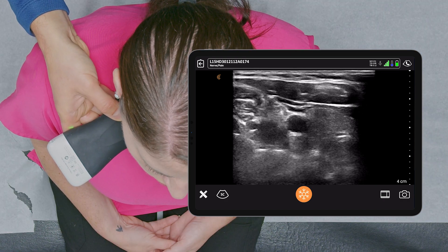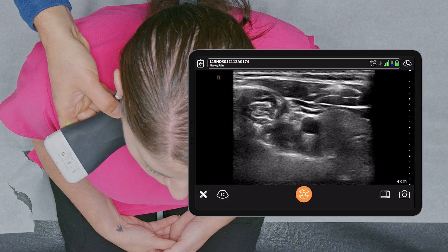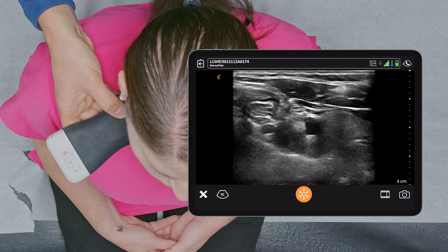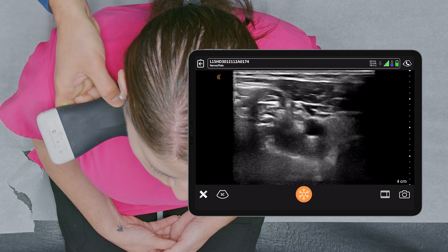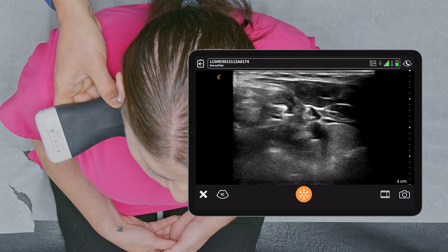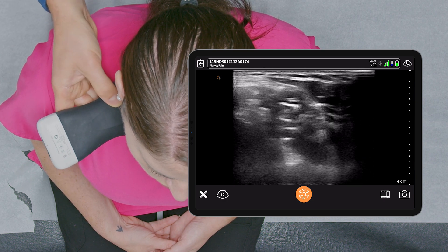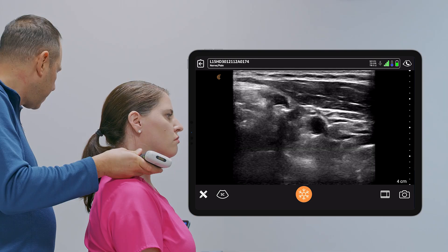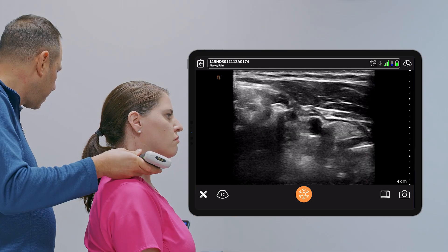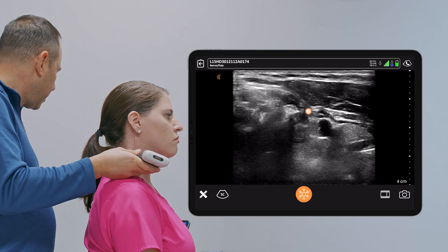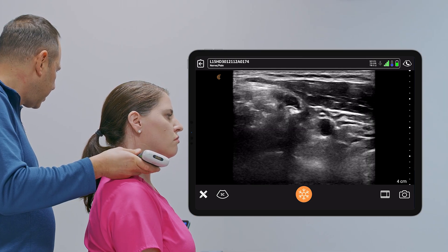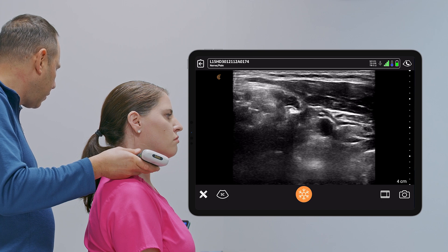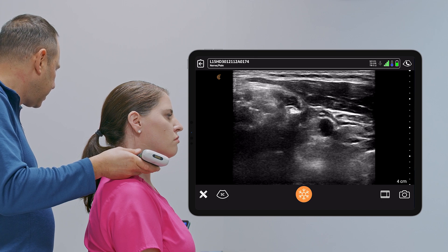Here we see the carotid, and at the level of C6 is Chassaignac's tubercle, which is hopefully going to come into view in a second — right there. The large anterior tubercle of C6.